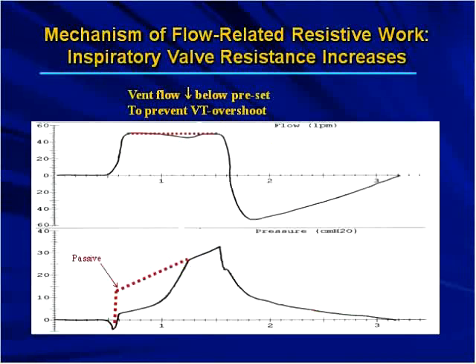Now, I kind of alluded to this, and here we see the pressure tracing in volume-controlled ventilation. If it was a passive breath, you would have the classic pressure step and slope up, but during patient-triggered ventilation, if there's flow starvation and mismatching, you'll see a scooped-out appearance.